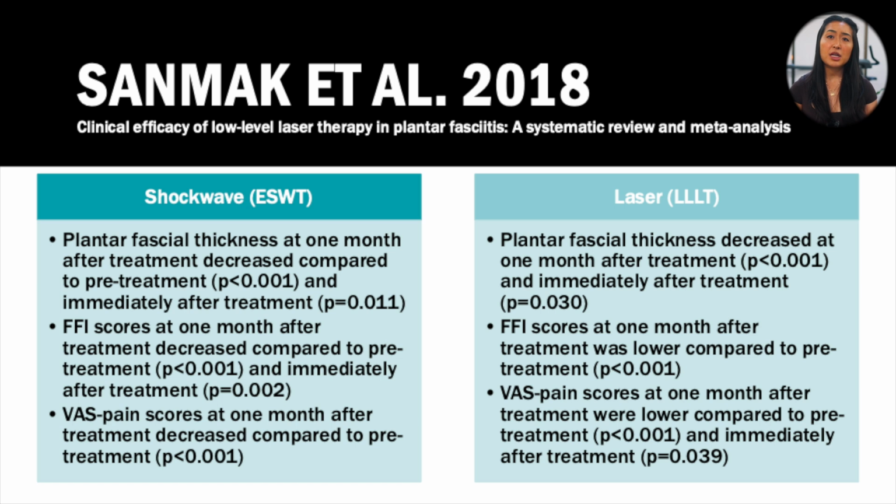This slide is a bit wordy, but basically they found statistically significant results based on their chosen outcome measures when comparing plantar fascial thickness, foot function index scores, and visual analog pain scale scores pre and post treatment for both shockwave and laser therapy groups. Again, this is available on the slide if you would like to take a more detailed look at their findings.